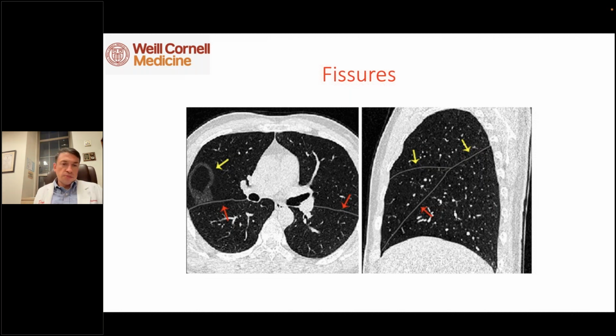And I have seen this many times in practice, despite what these CAT scans or these reports are showing. Very often, or more often than not, at least, the right upper lobe will not be a target for that reason. So statistically speaking, the left side is better than the right because there's only one fissure on the left, and so there's less probability of having interruption.